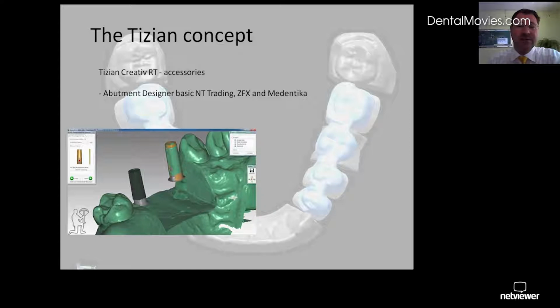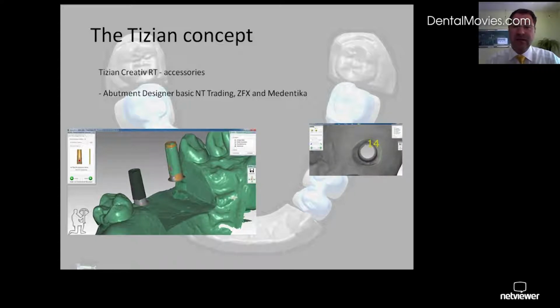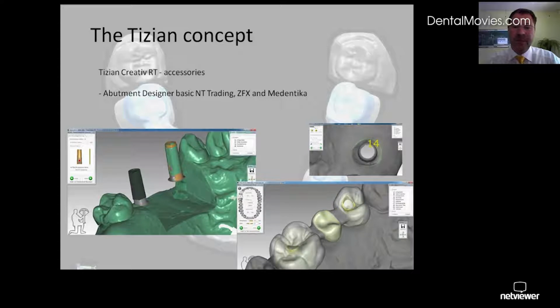And to prepare your later on construction, you need a second part which is called scan platform, interface platform or titanium platform. This is also a special part which has to be matched to the implant system which your doctor may use. So please make sure what kind of implants your doctor may use and if they are available already in the software. I will show you later on which systems are already integrated. So basically this is what you can do or what you do. Jochen will show you more in the details what the software is about.